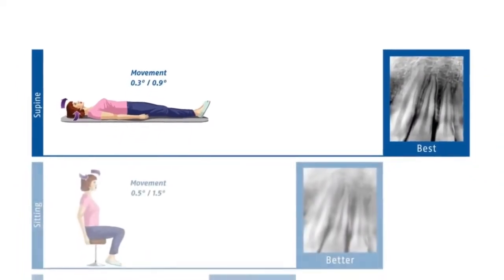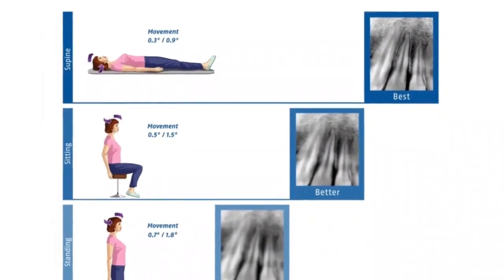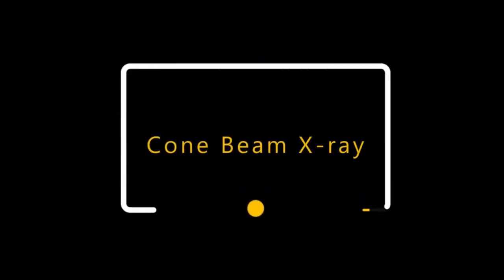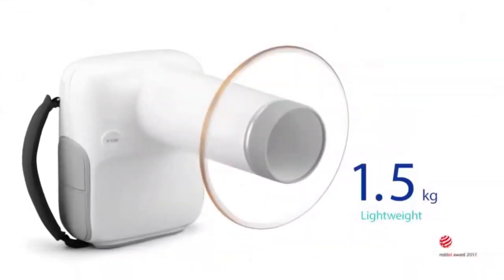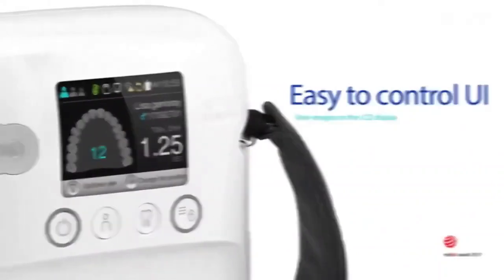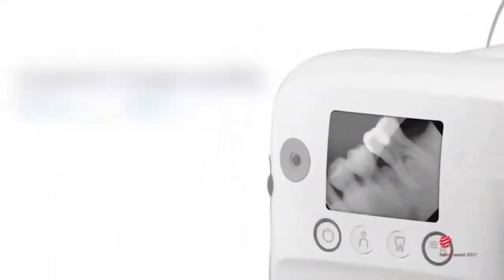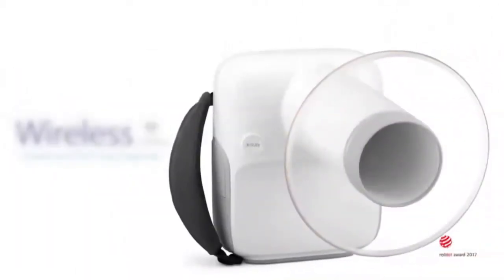Last, if you suffer from sleep apnea, dentists can often help, but yours may suggest a cephalometric projection first to clearly see your throat structure and determine the cause of your sleep apnea. The sixth X-ray technique, cone beam X-ray. CBCT, CAT scan, or cone beam X-rays are an imaging method that uses computerized technology to convert two-dimensional images into a three-dimensional picture. Compared to a traditional two-dimensional X-ray that shows a flat image, the 3D picture shows every dimension and aspect of the teeth and surrounding bone.